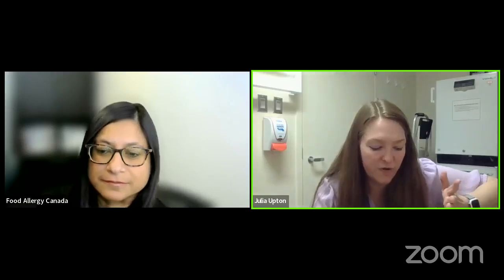We used to know that they were very good for quite a long time after expiry, but the companies actually changed the expiry dates in line with the evidence that showed that it was good for quite a bit longer than the original expiry dates. So we used to be able to say, oh yeah, 6 months, a year, it's basically the same, but they actually changed the expiry date. So ideally keep them within date, but yes, if that's all you have, then it's going to be better to use than not using it.